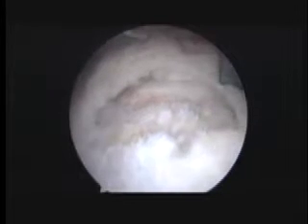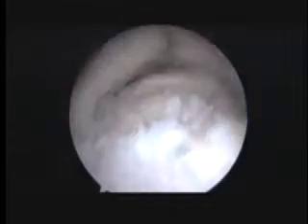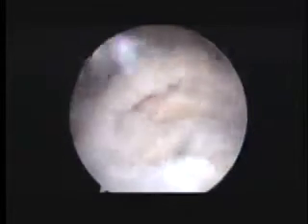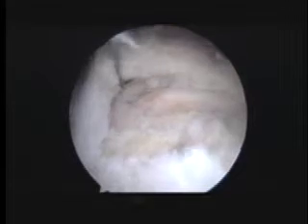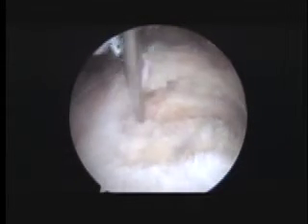Okay, so we're looking at this big hole in the tendon. We're going to place the spinal needle. This is the hole. It extends from here. This is posterior, and this is way over here anterior. And so we're going to start by placing a suture anchor back here. You can see we've got to get that deep layer incorporated into the repair. We're going to place our first anchor right about here.